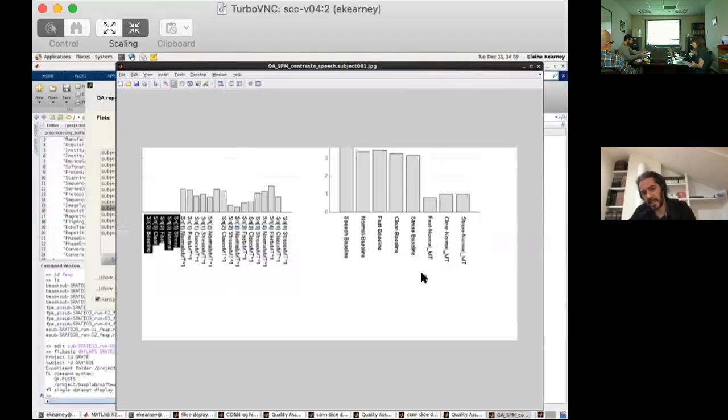And the fact that it's much higher for the contrast stress minus baseline as compared to the conditions might have something to do with our design. There might be better ways to design our data so that it doesn't have such high contrast for the things that we don't need as much contrast for, which are the basic individual conditions versus baseline, which we typically just use for reference, just to make sure that we are looking at the proper areas of the brain.